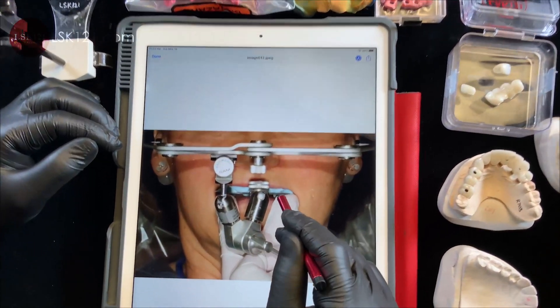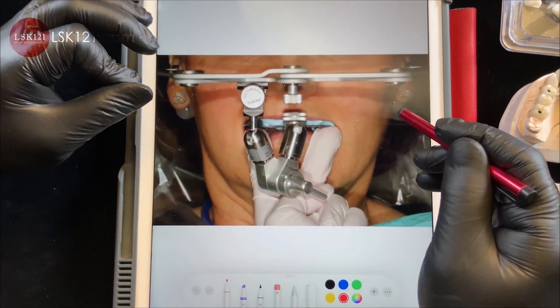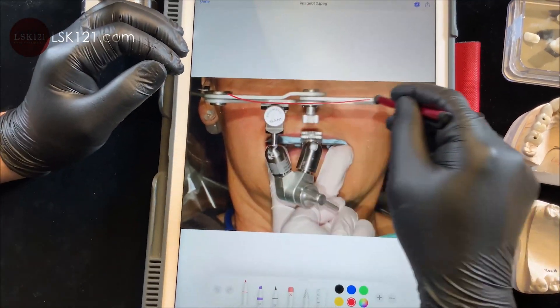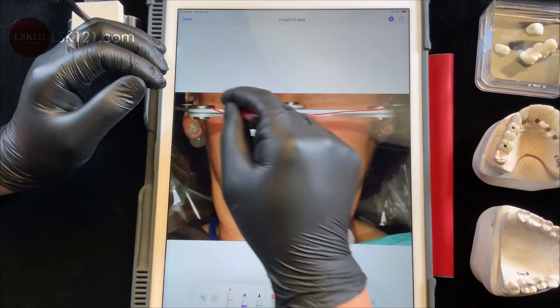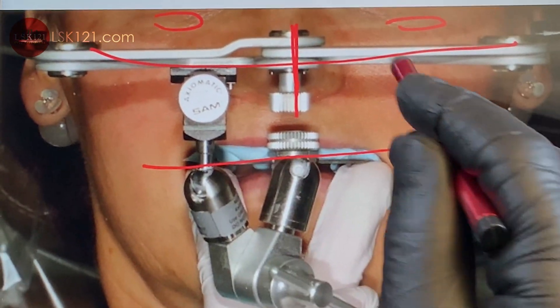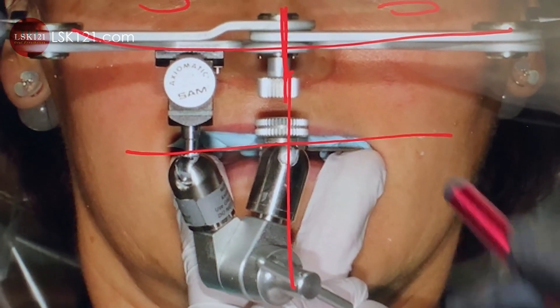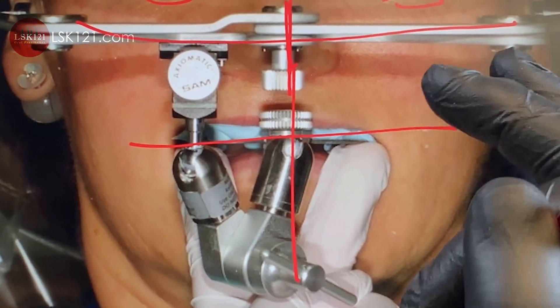This is a very complex case — an upper full-mouth implant. The doctors gave us a good face bow, from the eyes here, and here's the nose. Then horizontal and vertical: horizontally I can get it, and vertically it's a nice presentation.